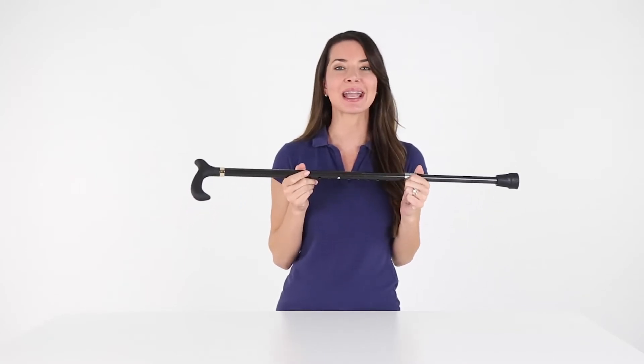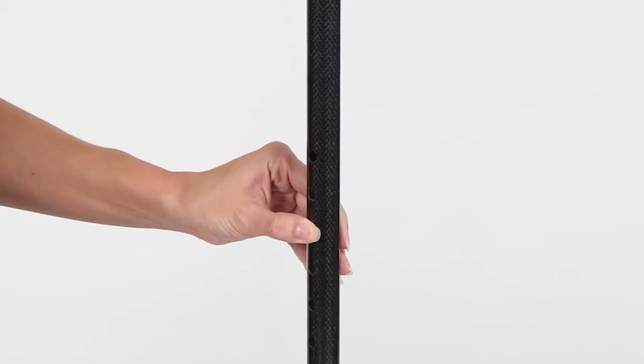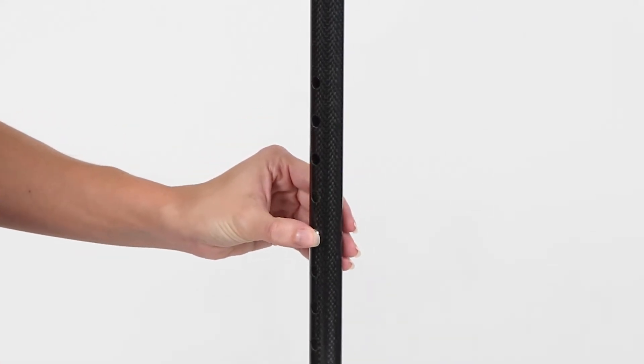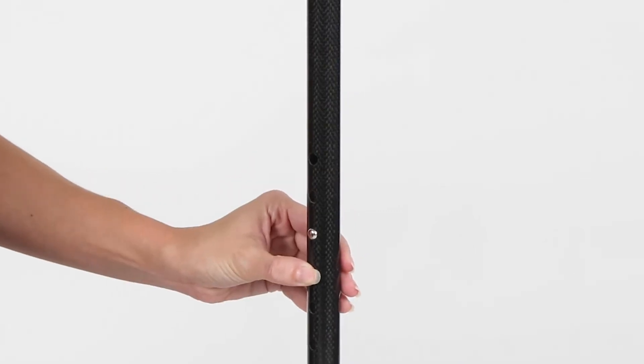Easily adjust the cane to your height without hand tools. With a range from 29 inches to 37 and a half inches, use the secure locking latch pushpin system for a personalized fit.